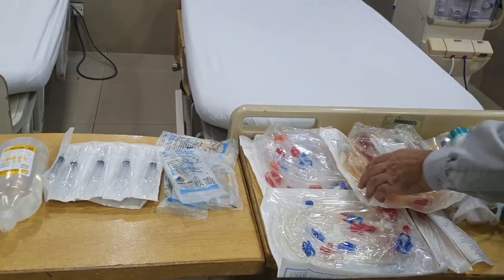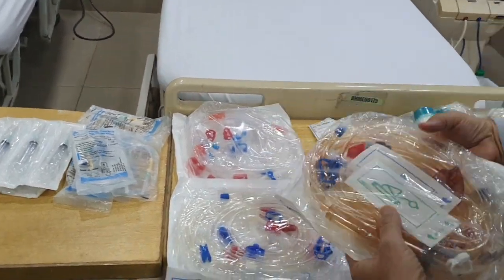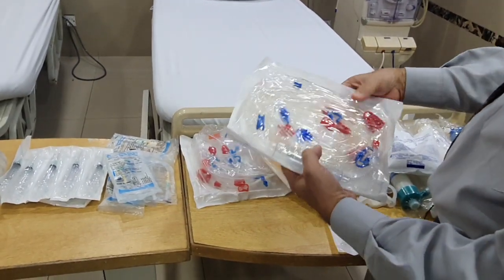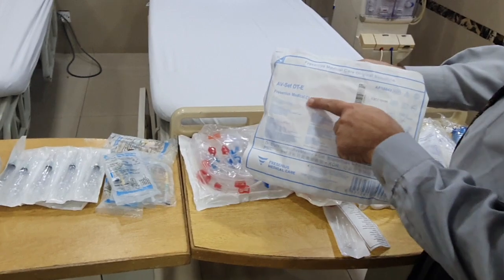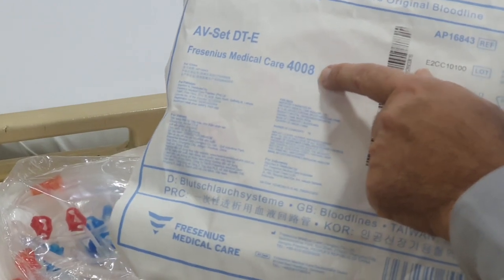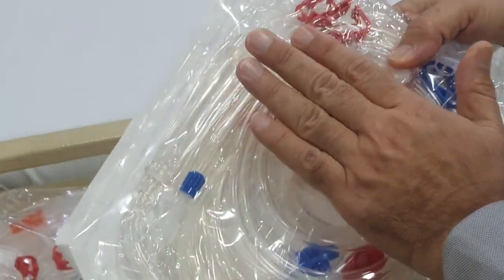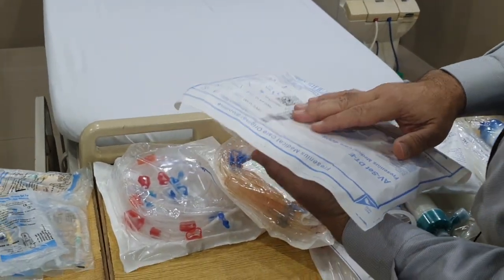But coming here, now these are the important ones. Here are the blood tubing lines. This particular blood tubing line, if you can see, is different from these ones. This is a universal blood tubing line, and when I say universal, it can fit on virtually most of the dialysis machines which are available in the market. If you read here at the back, this is 4008. That means the Fresenius 4008 machine, which is one of the older models of Fresenius dialysis machines. But this can be used on virtually all of the other models of dialysis machines made by different manufacturers.